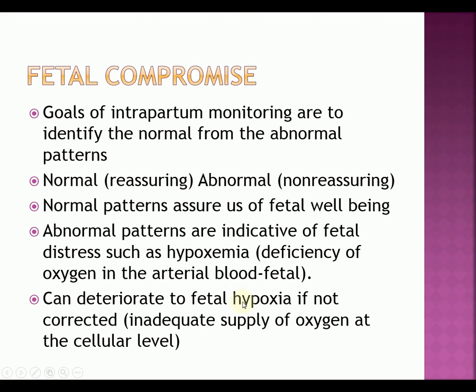All right, so we're going to talk some about fetal compromise. I just wanted you to explain how to do the uterine contractions. So you should be able to know frequency, duration, intensity, be able to do it by either palpation or by intrauterine catheter monitor. So you've got external, internal methods. We also have external, internal methods of measuring fetal heart rate. We have the fetal scalp electrode, and then we have the external monitor itself. So we'll go through that as soon as we get to it in the chapter.